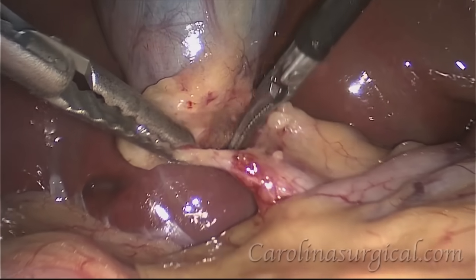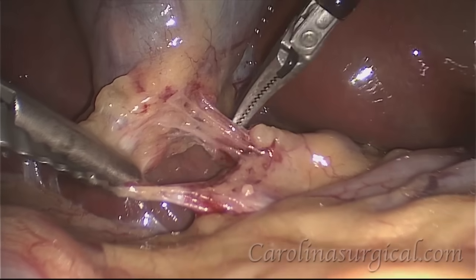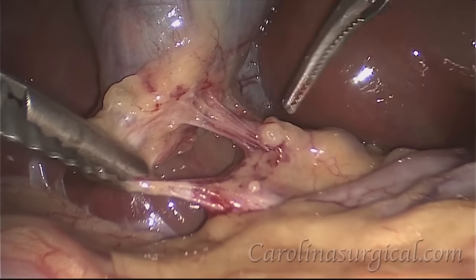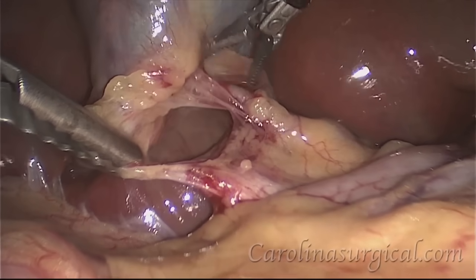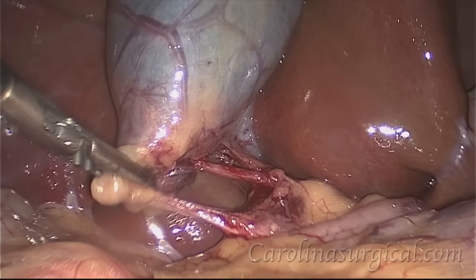Behind the cystic duct, we're going to start looking for our cystic artery, which supplies blood to the gallbladder, and you can see this pulsatile vessel coming into view now. That is the cystic artery.